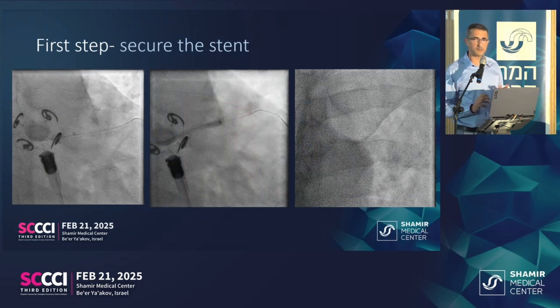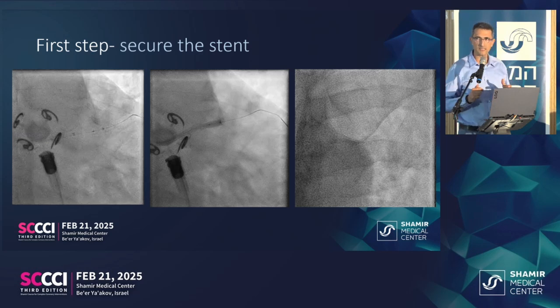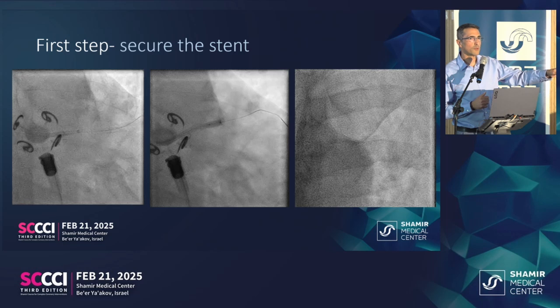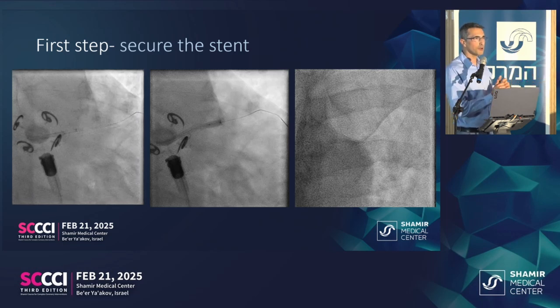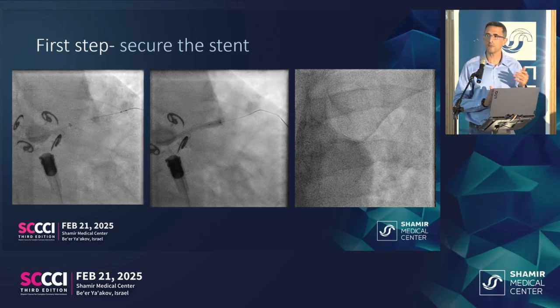First things first, we thought of safety. This is exactly what I had in mind when Asa was presenting. Before that, Ilya was in the room giving weird advice. Instead of listening to him, because I listened to him previously, I should just put a balloon, secure the stent distally, and prevent it from running off.